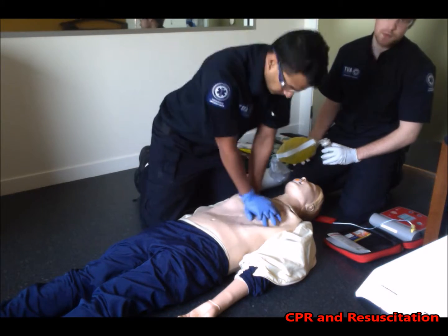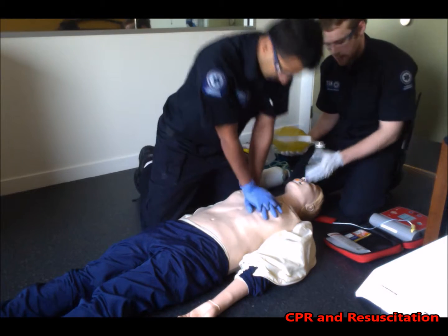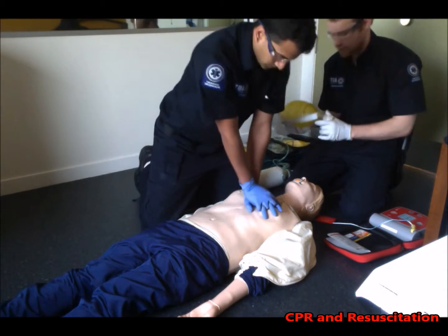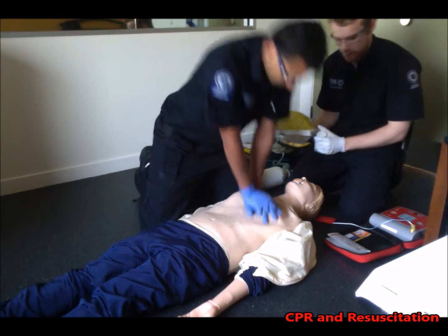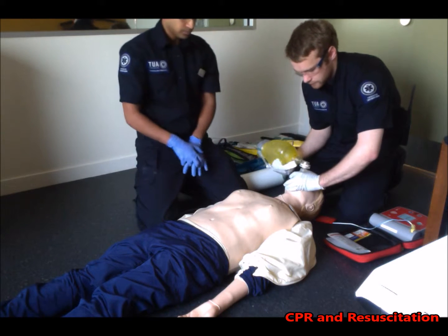In addition to this, we can use the suction tool to scoop out any build-up of saliva or any obstructed gastric juices that may flow out of the... 25, 26, 27, 28, 29, 30. Stop CPR.